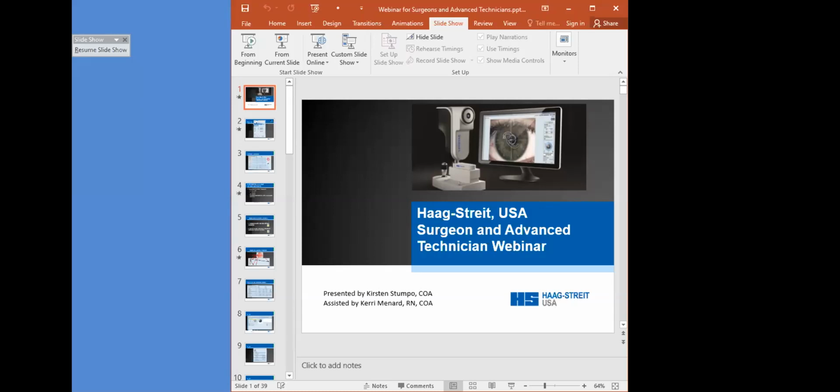I'm going to say reach out to your colleagues to find out what others are doing. But I do know that Haag-Streit has mentioned that immersion and optical are so very close that it's acceptable to use those optical A constants when calculating. The bigger difference is that contact A scan when you're indenting the cornea and only measuring to the inner limiting membrane.